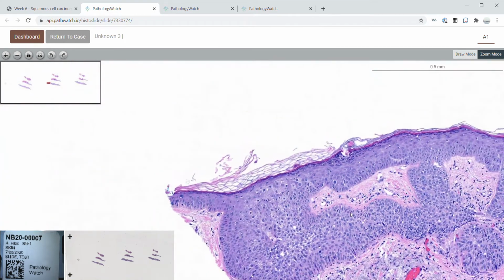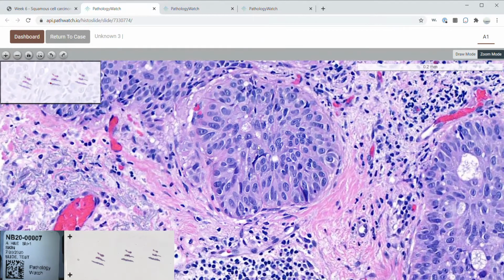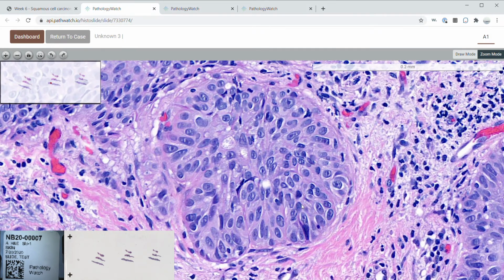Many times, in the same biopsy specimen, you can have invasive squamous cell carcinoma. Invasive squamous cell carcinoma is atypical keratinocytes that are present as nests in the dermis. The level of keratin differentiation is important, and this is denoted by eosinophilic cytoplasm as well as keratin production. You can characterize squamous cell carcinoma as well, moderate, or poorly differentiated, dependent on the amount of keratinization present.